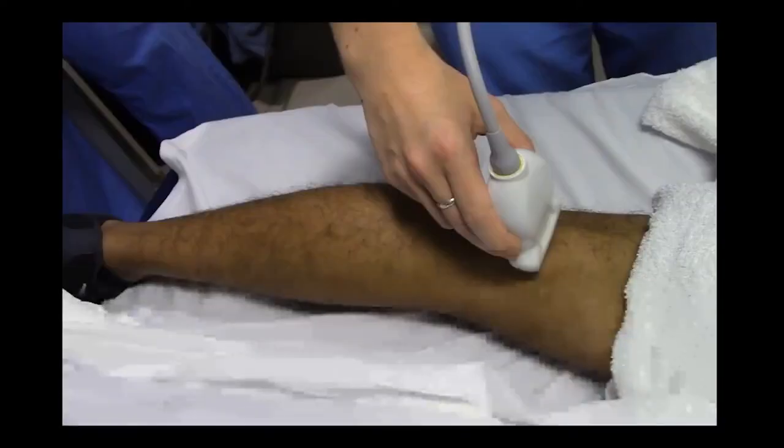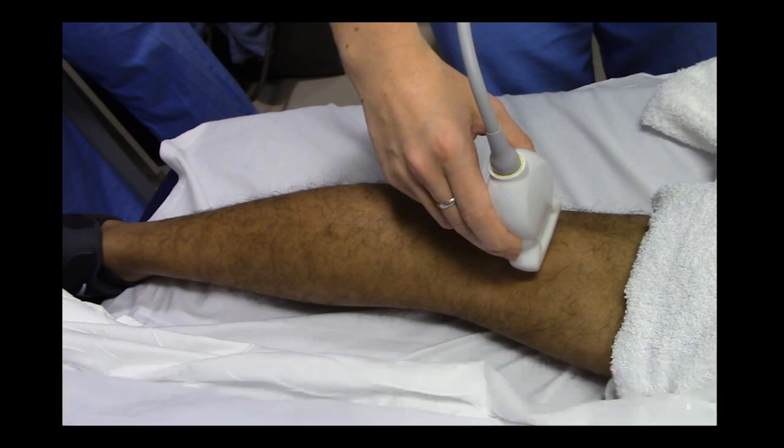When performing this exam, you want to be as comfortable as possible. So position yourself in a manner that the device is directly in your line of sight. And then it's important to make sure you orient the transducer indicator to the image displayed on the screen, which is usually the right side of the patient when possible. Notice the examiner's hand position in this image, with the indicator not shown in this image, but usually on the patient's right side.